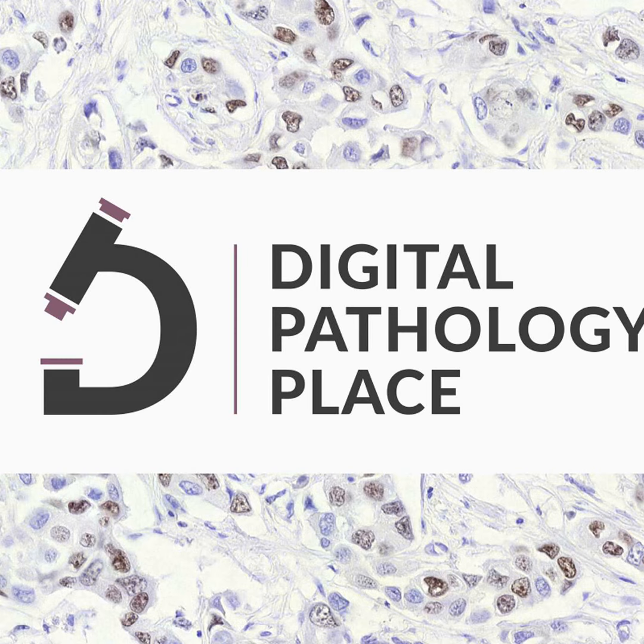what's happened to us is I will train a deep learning model, let's say to do segmentation or identify where a tumor is. The model will work fantastic on my personal data set. Someone else will say, can I use your model? Yes, I give them my model. Results are very bad. Why are those results bad? I don't know. So then I say, can I see some of your slides? They send me some of their slides. Their slides look fundamentally different than my slides, right? Maybe they're much brighter or much darker. We know, and a lot of people have put out numerous publications showing, that deep learning is not robust, we'll say, to slides prepared from different sites.